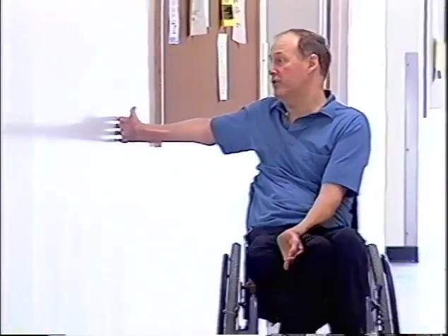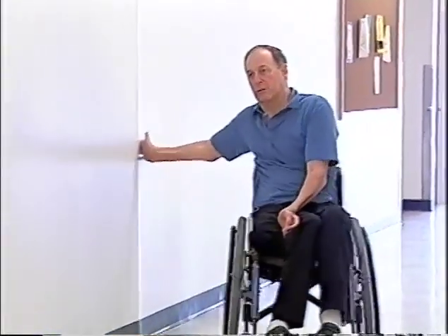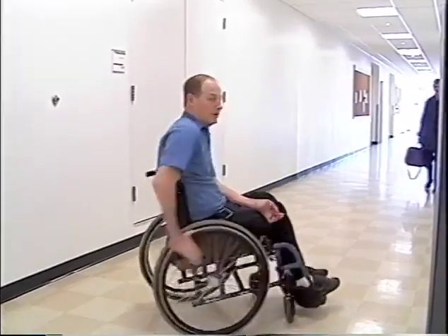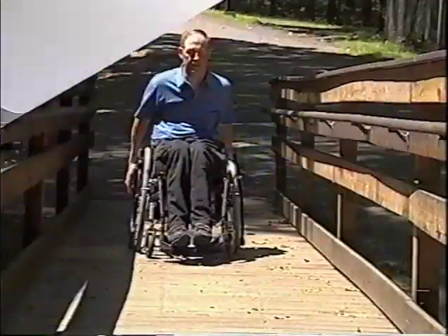The way that it works is you're pushing off of the wall and turning yourself out, and then touching the wall and bringing yourself in. So you want to be going out and in, out and in. And you can go all over the place with this type of technique, out and in. And you can turn going around other corners. So learn how to wheel with one arm. That way if you ever hurt your shoulder or if you're carrying a cup of coffee, you'll be all set.